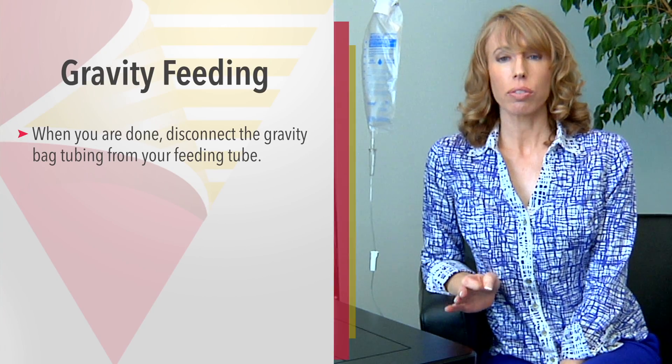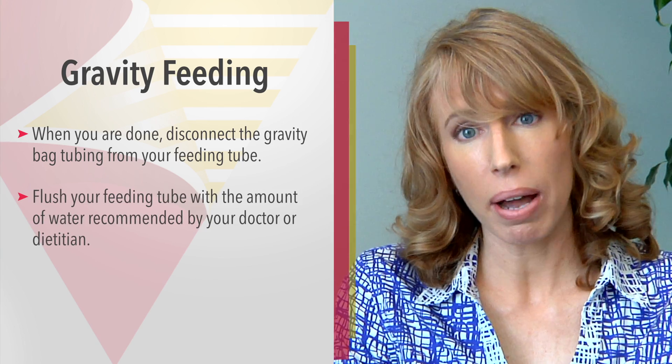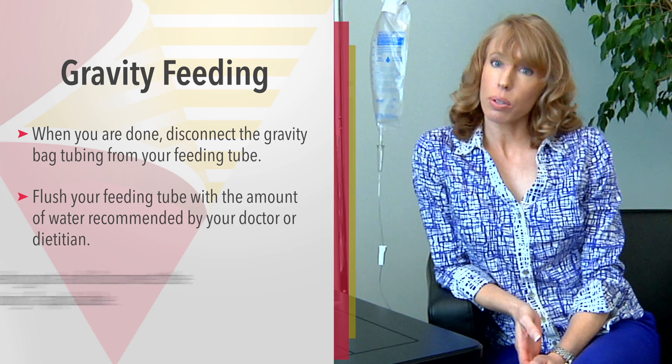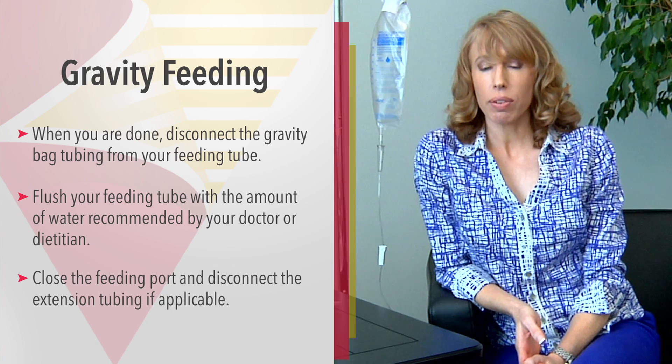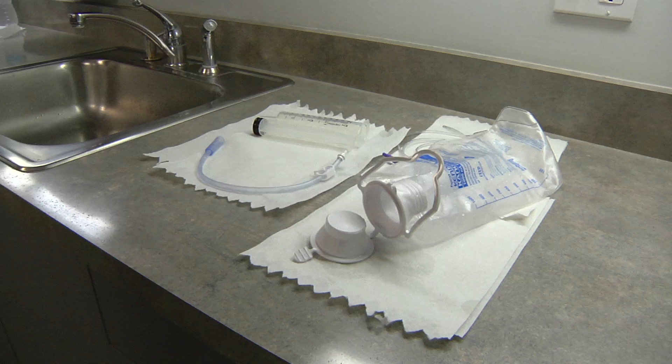When you're done feeding, remove the gravity bag tubing from your feeding tube. Be sure to always flush your feeding tube with the amount of water recommended by your doctor or your dietitian. Close the feeding port. If you have a low profile feeding tube, remove the extension tubing. Be sure to always wash your hands and wash and air dry all the equipment that you used. You can refrigerate leftover formula for up to 24 hours.